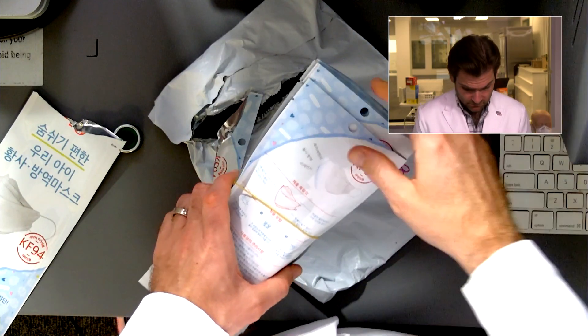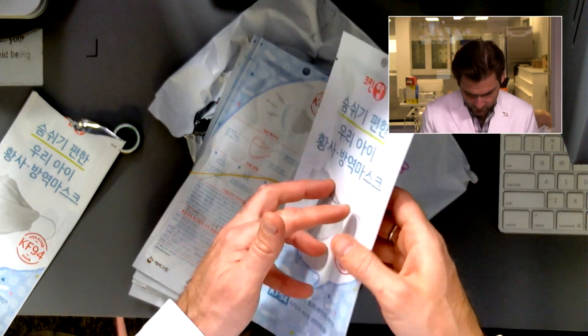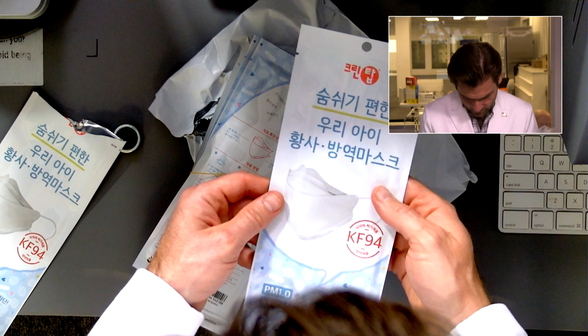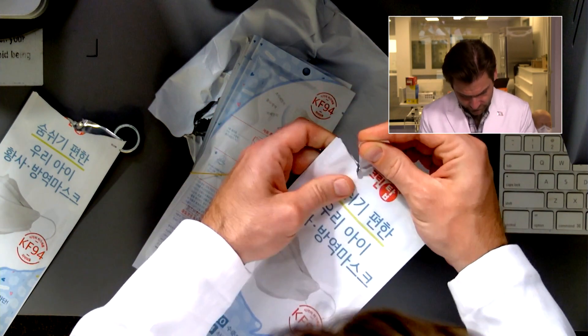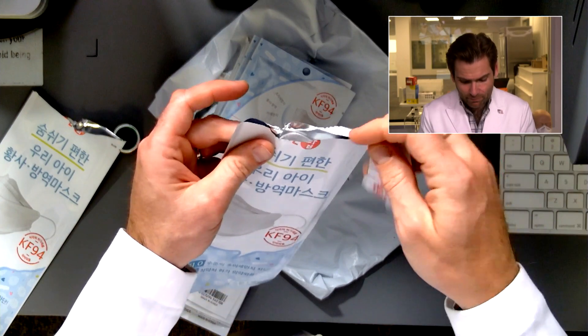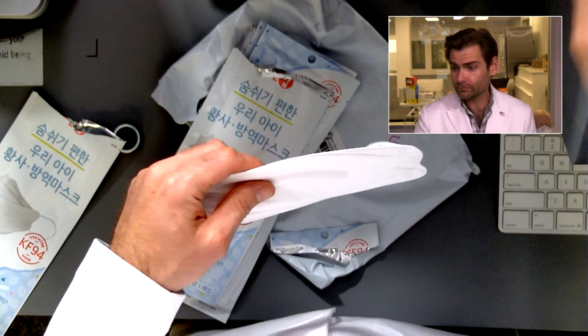Let's take a look at the mask. I like this cute flowers design. PM 1.0 — that's interesting. The design of the packaging keeps catching on the mask when I open it — that's annoying. Oh, that's so strong. Wow. Good nose wire.